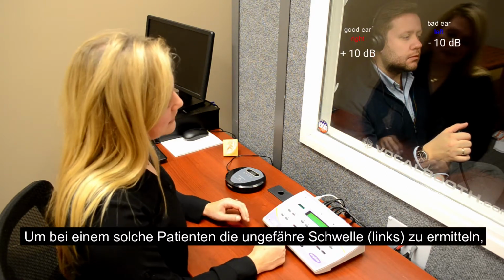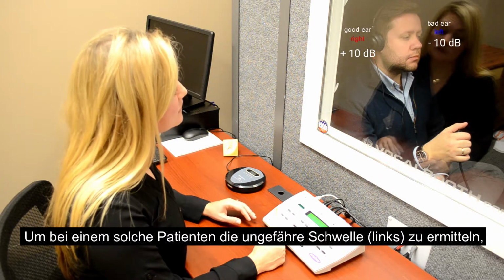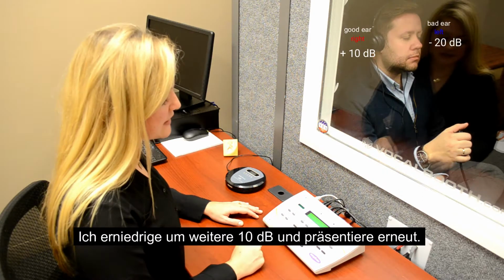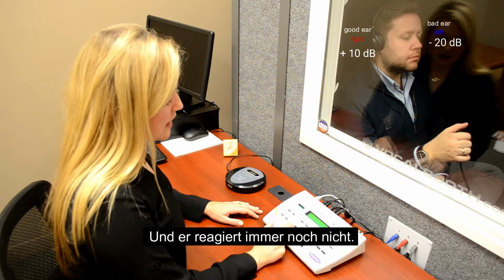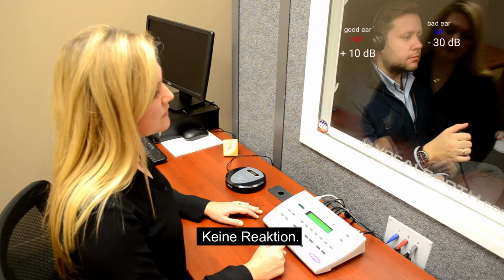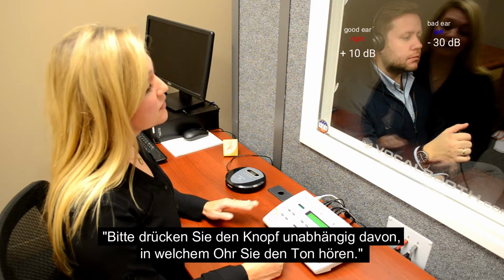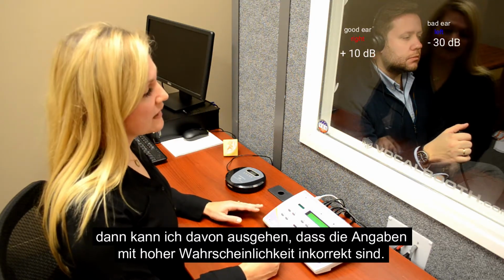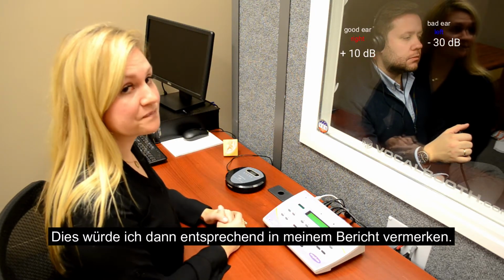And if you have a patient like this, if you want to try to figure out what their possible threshold is or something close to their threshold in that left ear, you can continue to decrease it. So I'm going to decrease it by 10 again and present it, and he still didn't press the button. And so I'll try again and decrease it by 10 and press it, and he's still not responding. So at this time I could re-instruct him and say, press the button no matter where you hear it. But if he still doesn't participate, then I know that what I'm getting in the left ear is probably inaccurate. So I'll just write that in my report.